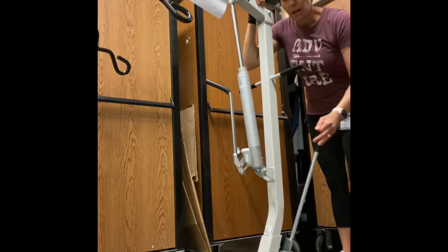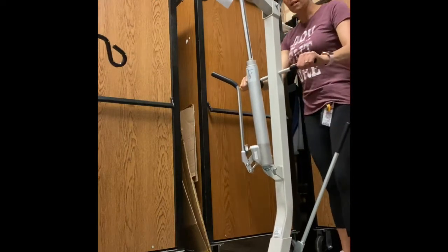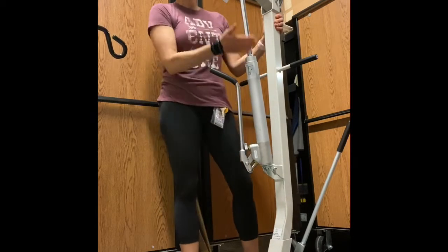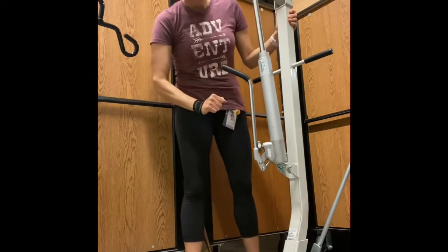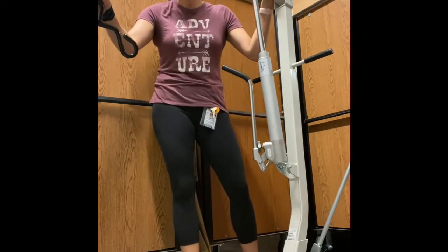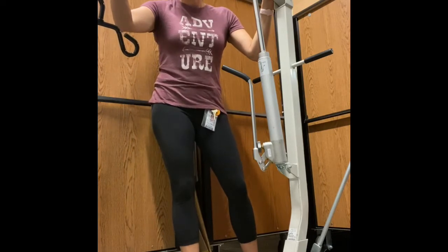They can be in either position when you're using the Hoyer for the transfer. The next knob to be aware of is the lower and raise knob, which controls the hydraulic within the Hoyer. If your Hoyer is not working, do not use it. You need to contact your vendor to get that working, because it can cause injury — dropping too fast or not holding the patient.